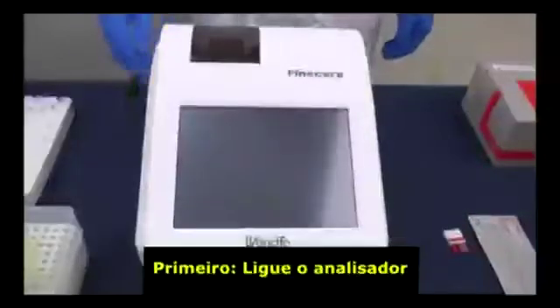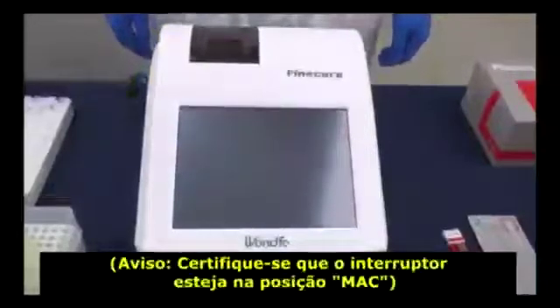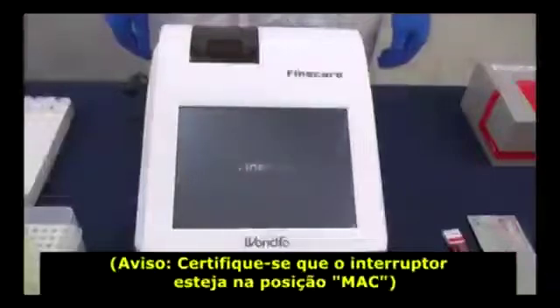First, power on and turn on the switch. Notice, the switcher needs to be maintained in MAC position.